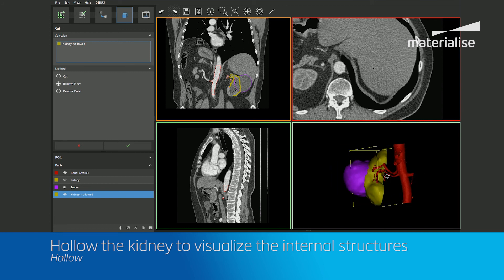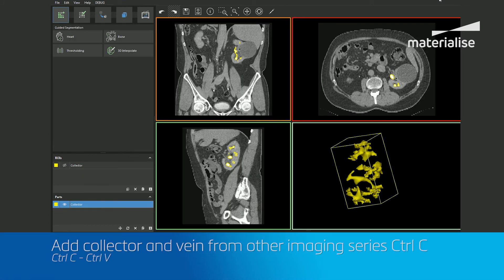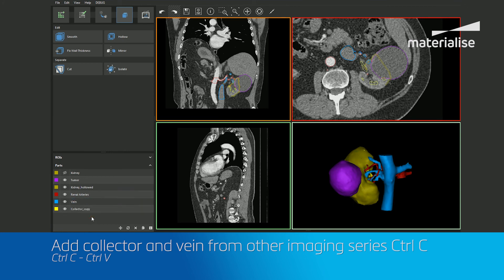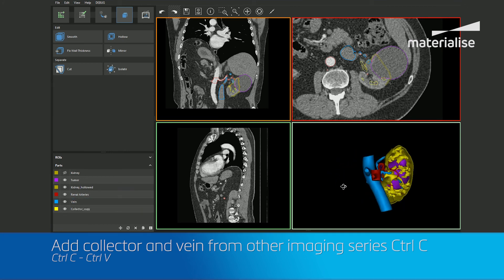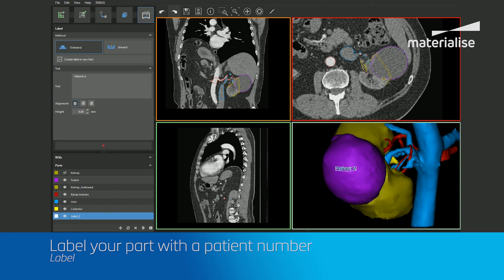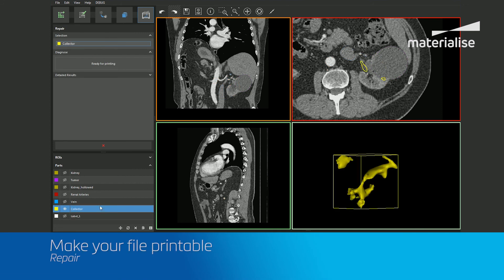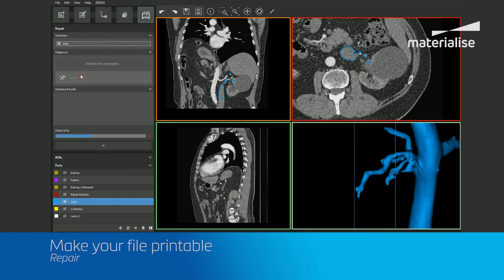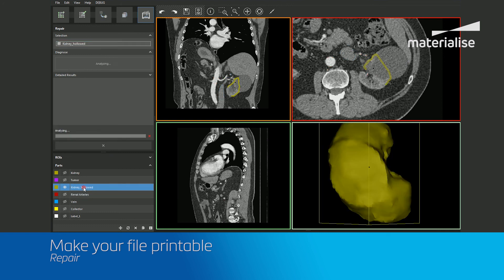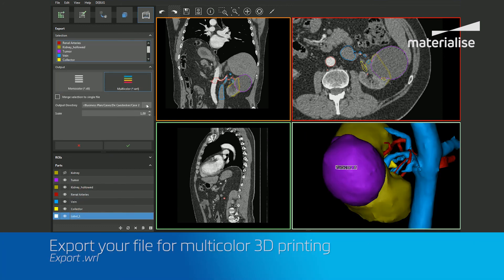To obtain even more anatomical information in our model, we'll copy-paste the collector ducts and renal veins that were segmented from a venous phase image series into our current project. Next, we'll add a label to our model for traceability back to the correct patient. It's also important to run each part through the repair tool to ensure we export a printable file. And then lastly, we'll export a multicolor file that's ready to be 3D printed.